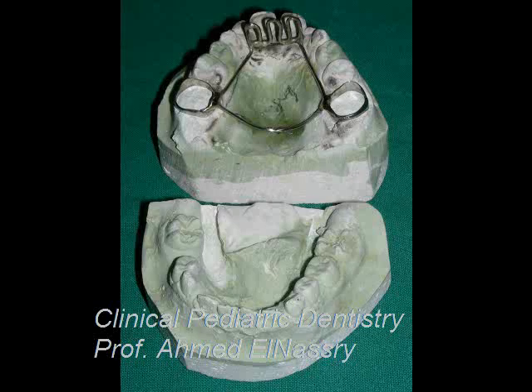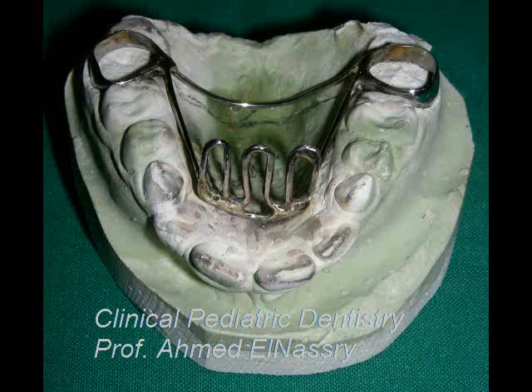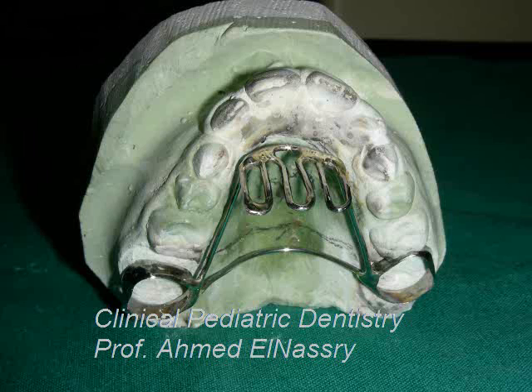The habit-breaking appliance is called a tongue guard or palatal crib. It is a well-known, universal, and very simple appliance, composed of two bands reinforced by a transpalatal wire and a wire extended anteriorly with a vertical extension.